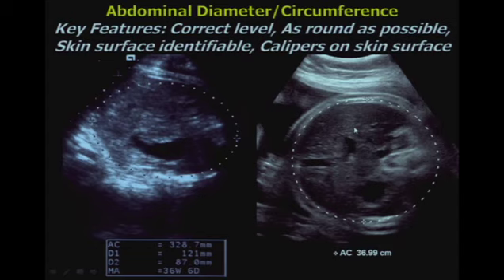So I've come to the end of the tour of obstetrical ultrasound measurements and indicated which ones I think are important.